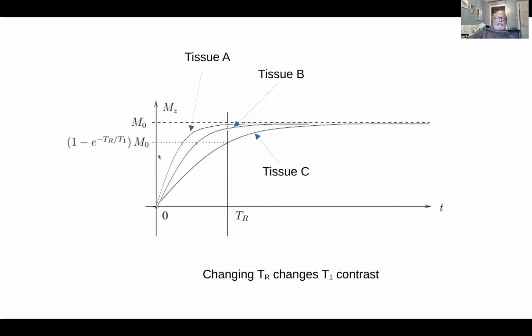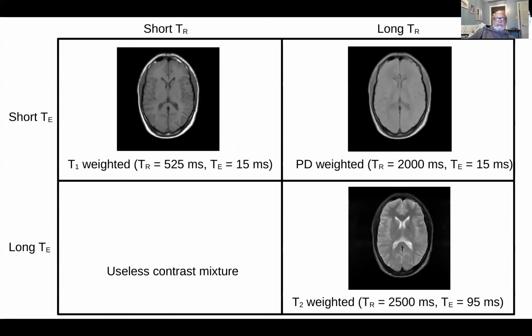So you can think of this axis here. It's the longitudinal magnetization, but it will show up in your picture as brightness from black to white, with basically you can think from 0 to 1, with 1 being white and 0 being black. That'll be digitized, of course. So if you have an 8-bit image, it'll go from 0 to 256. So these are all details that you'll need to worry about as you write actual pulse sequences.